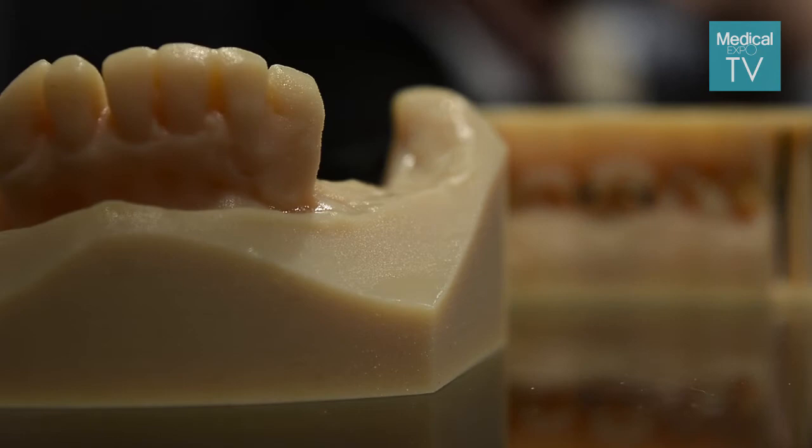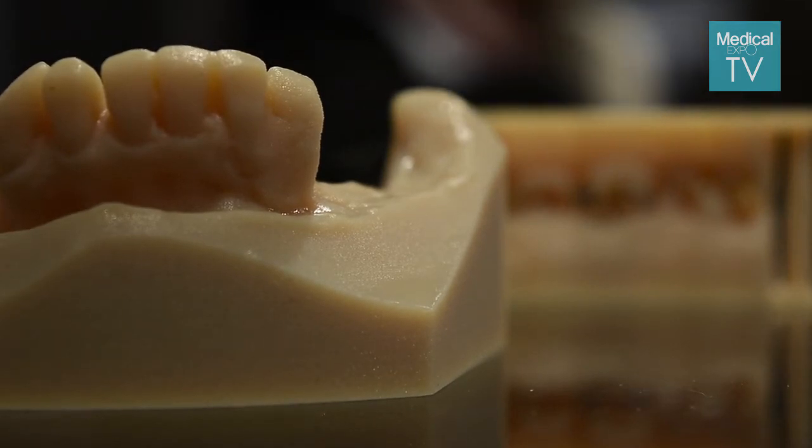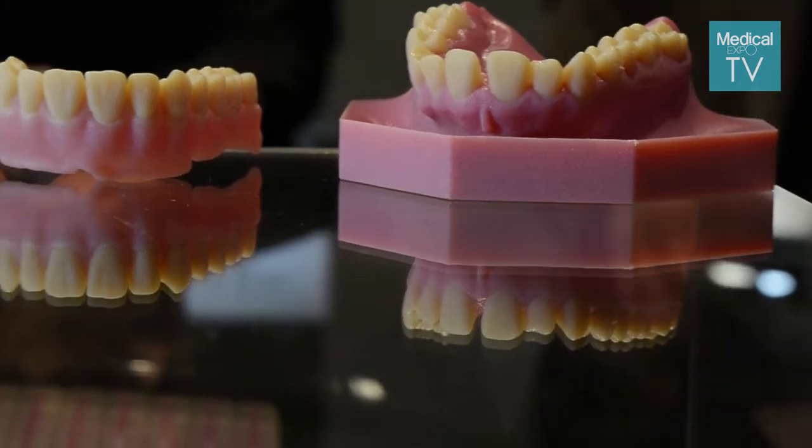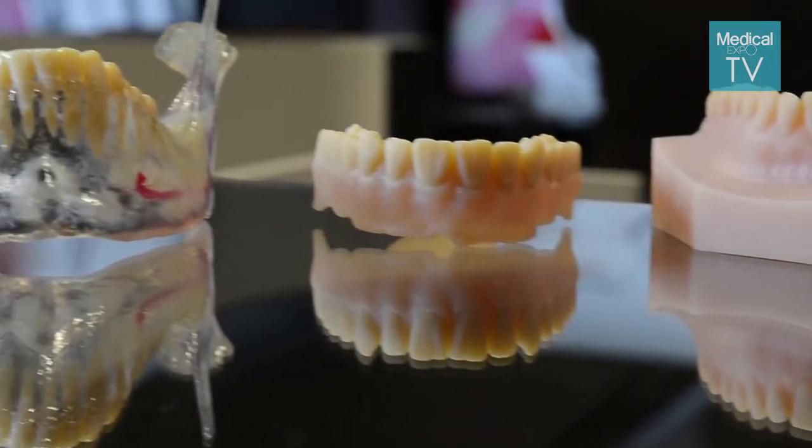The future of digital dentistry, looking years ahead, is definitely moving toward end-user chairside printing of real crowns, temporary or provisional teeth, crowns, bridges, and dentures. All of it — this is where the vision and the future of the industry is heading, and this is definitely where it's going to go.